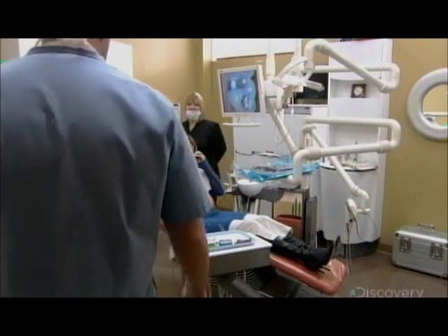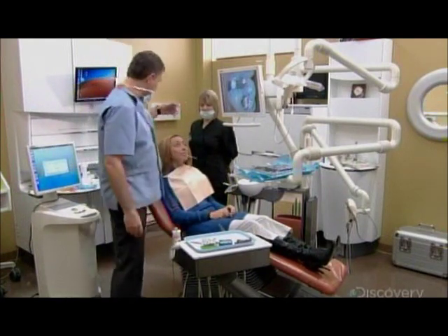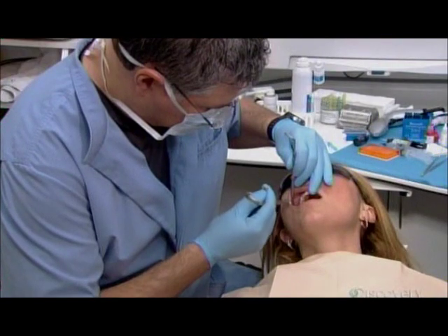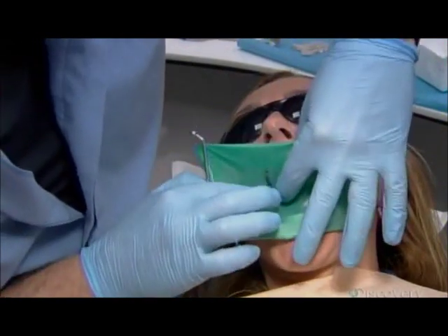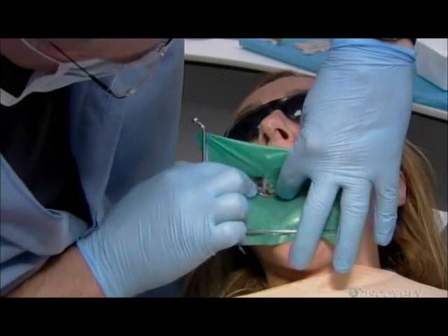The dentist meets the patient and reviews her case. They agree to replace the silver filling with a ceramic inlay, which will strengthen the tooth for much longer than a regular filling. He anesthetizes the tooth and the gums that surround it, then stretches a rubber dam across her mouth and exposes the area to be treated through a slit, keeping filling fragments out of the patient's mouth as he drills.